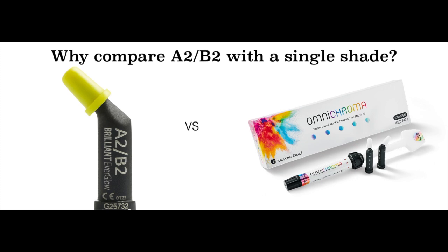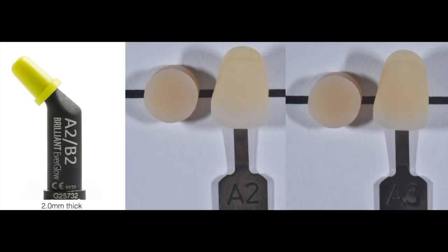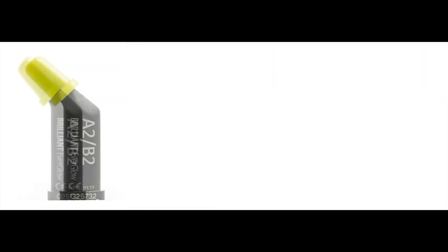In the last portion of my presentation, I want to address why I am comparing Brilliant EverGlow A2B2 with Omnichroma. In other words, why not compare A3D3 to Omnichroma? The number one reason is that when you take cross-polarized photos, which by the way eliminate any glare created by the flashes, of cured Brilliant EverGlow A2B2 right next to an A2 or an A3 Vita Pan shade tab, as seen on the photo, they both have a good match.